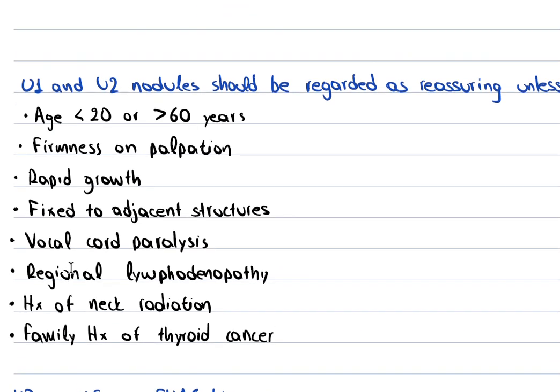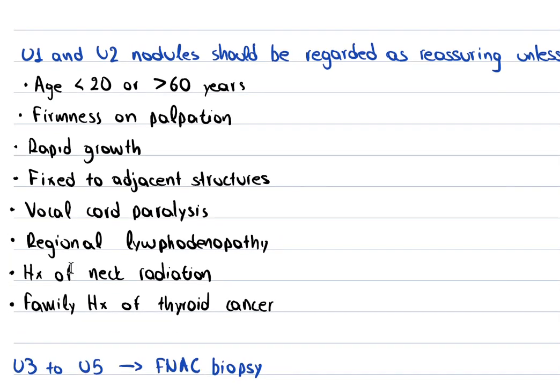That's it about the ultrasound guided classification of thyroid nodules. Next, we will study about FNAC findings and types of FNAC biopsy findings.